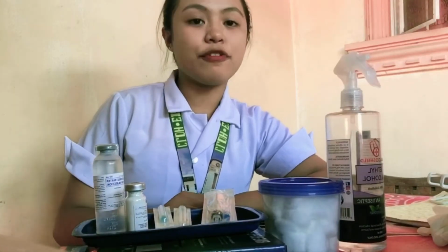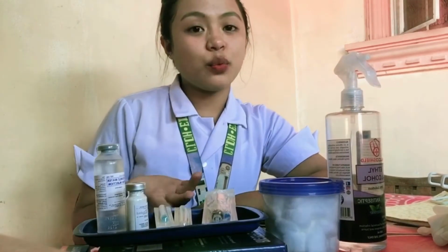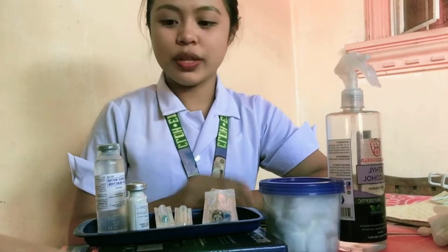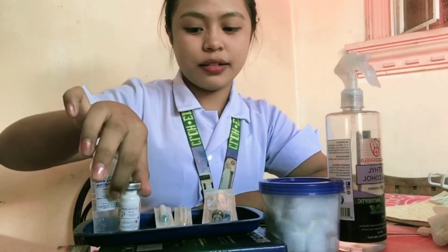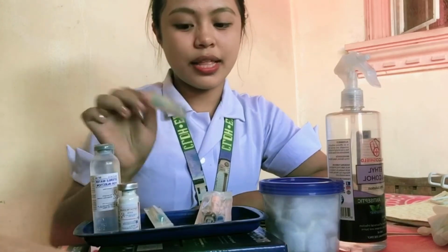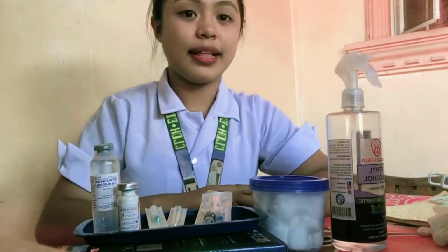After performing hand hygiene, we need to proceed in preparing the things that we need in administering the medication from a vial. First, we need our sterile water, our powder vial, our 5cc syringe, our aspirating needle, and a clean cotton with alcohol, and that's it.